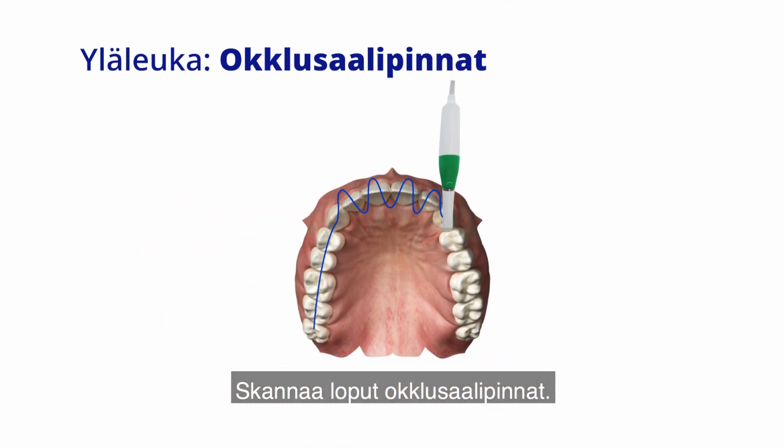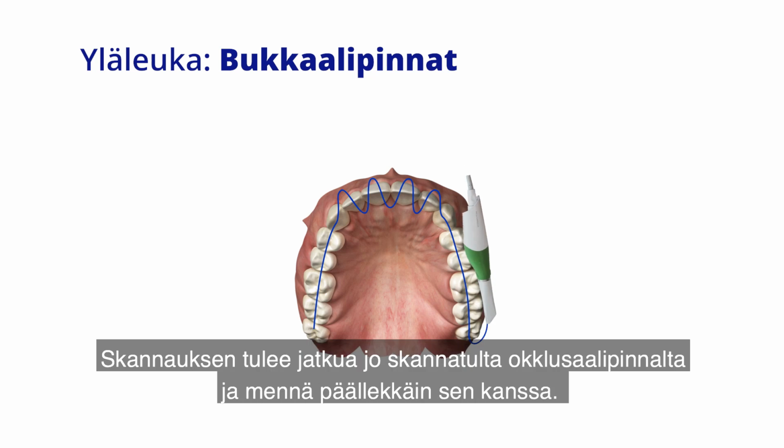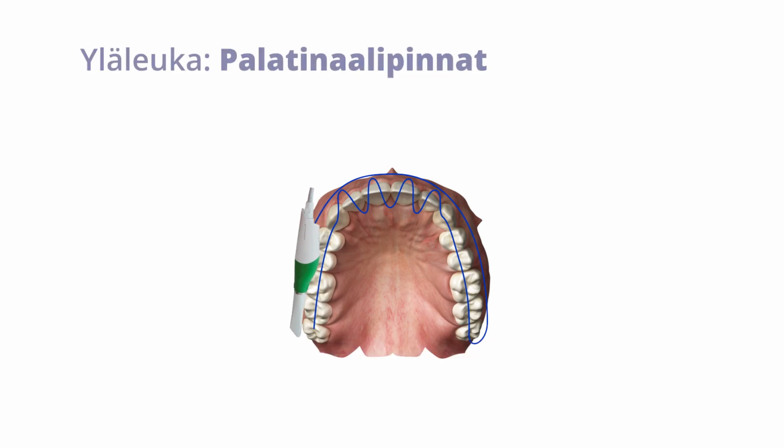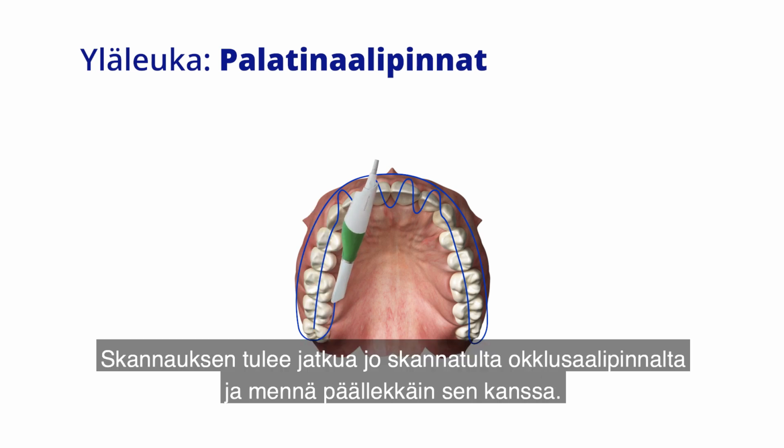Scan the occlusal surface of the entire arch. Next, scan all of the buccal. The scan should continue from the occlusal surface already scanned and overlap with it. Scan all of the palatal. The scan should continue from the occlusal surface already scanned and overlap with it.